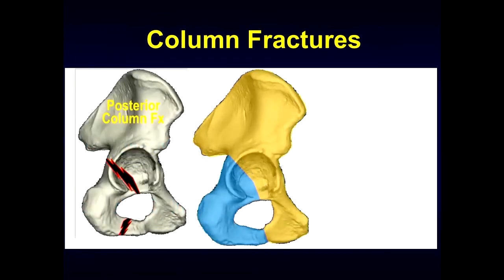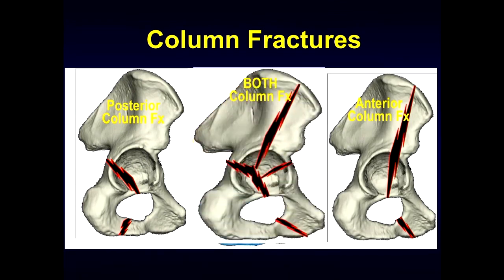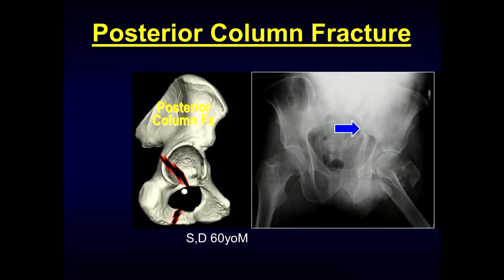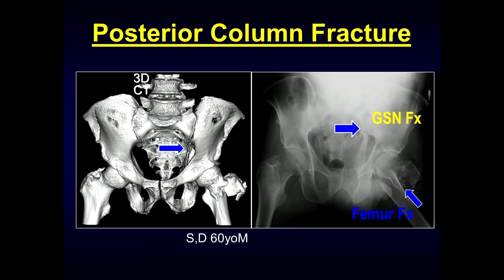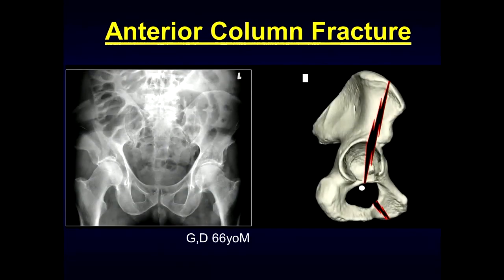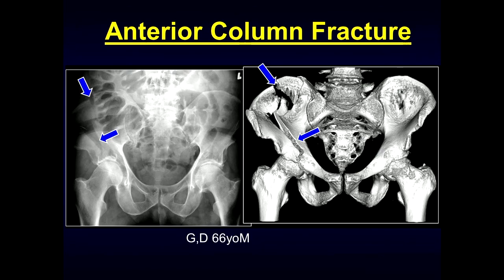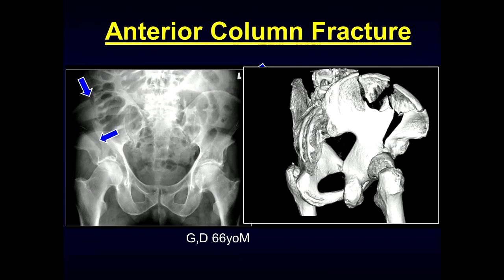Here is a posterior column fracture extending up to the sciatic notch, involving the obturator ring. The anterior column fracture extends up into the iliac wing. In this example of a posterior column fracture, we can see it extends upward into the sciatic notch, and this patient also has a proximal femoral fracture. At CT, the fracture extending to the sciatic notch is also well demonstrated. Here is an anterior column fracture with extension up into the iliac bone extending down into the acetabulum, also shown sagittally.